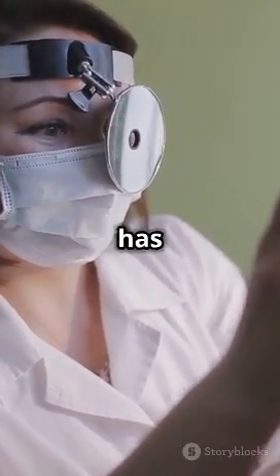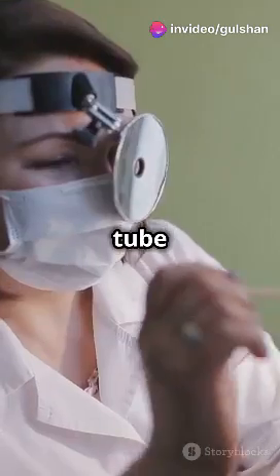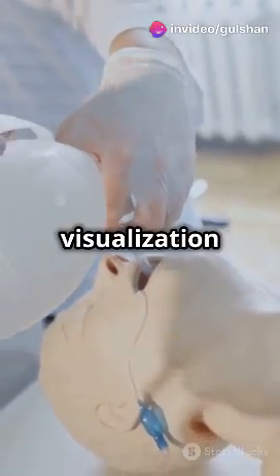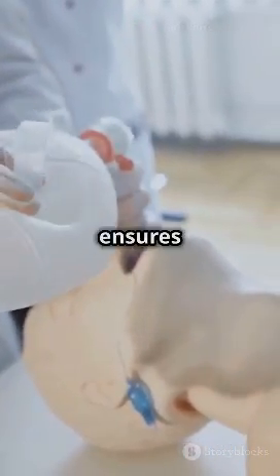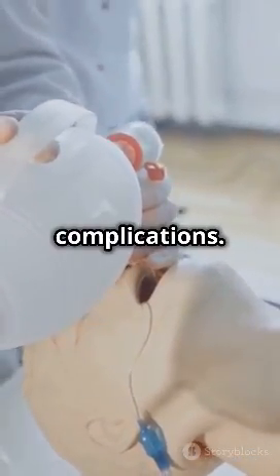The laryngoscope has a light and a camera that provide a clear view, making it easier to guide the tube into the correct position in the upper part of the windpipe. This visualization step is crucial because it ensures that the tube is placed correctly, reducing the risk of complications.